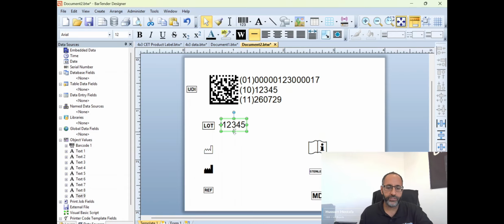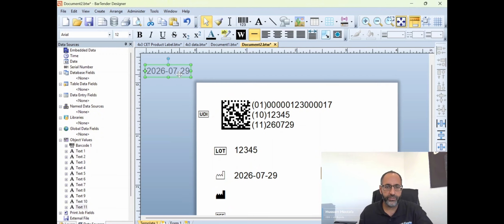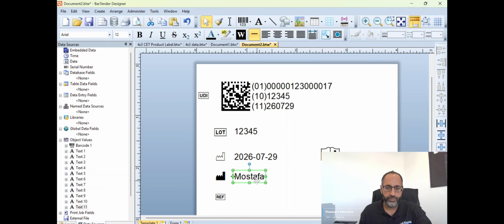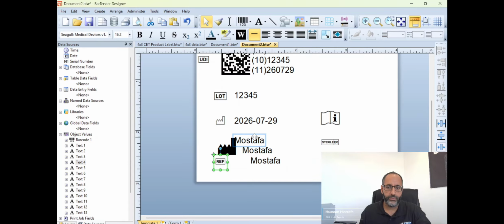The manufacture date, I'm just going to copy this, put it over here. Go ahead and put the manufacture date we said is, it's going to be the year, followed by the month, followed by the day. So we have that in there now. Manufacturer location, so go ahead and copy this and put that also next to the symbol. So then we could have in here, for example, I'll just put it here, manufacturer, put Mustafa, and let's make this, okay, add the address. So let's probably make this bigger. Bring this down. Okay.